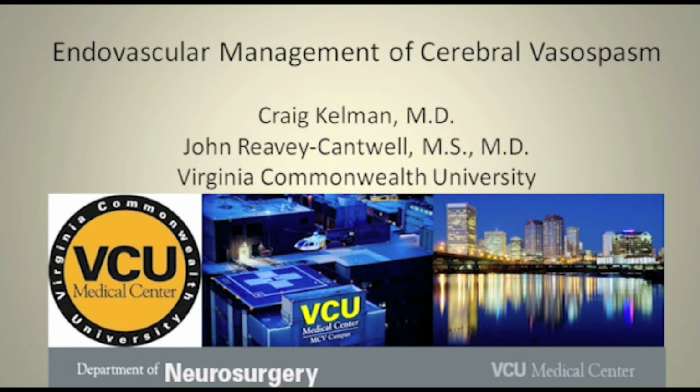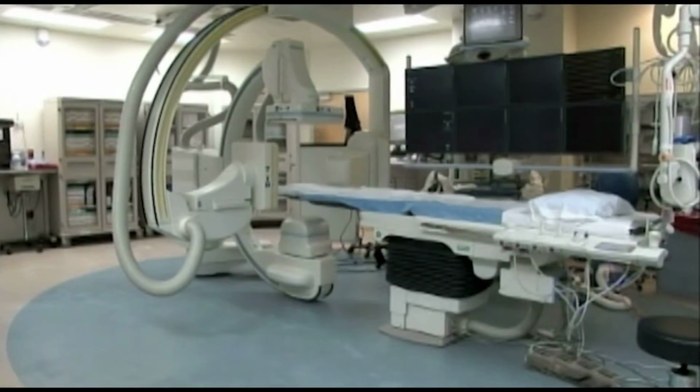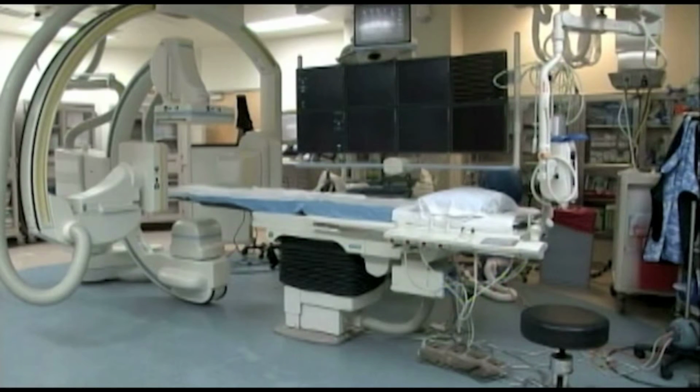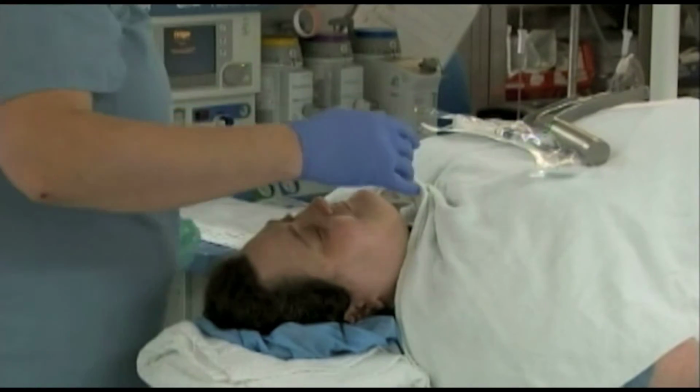I am going to talk about our protocol for the endovascular management of cerebral vasospasm. In our institution, the patient is brought to a hybrid endovascular operating room. They are laid supine on the angiography table. All patients undergoing endovascular intervention are placed under general endotracheal tube anesthesia.